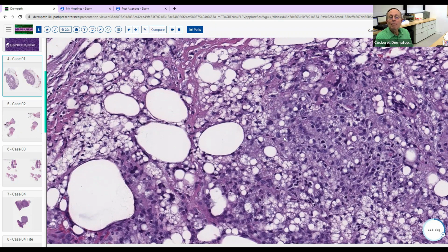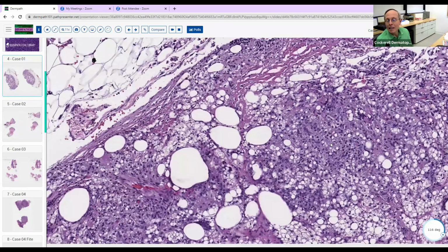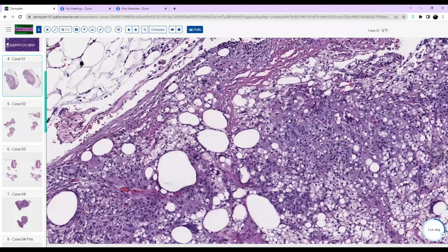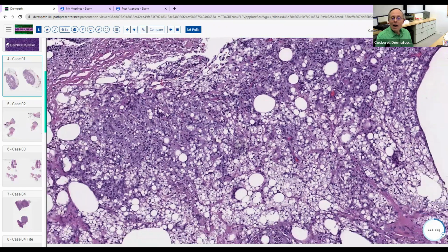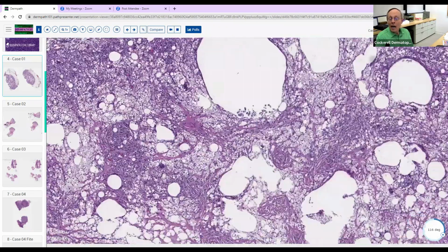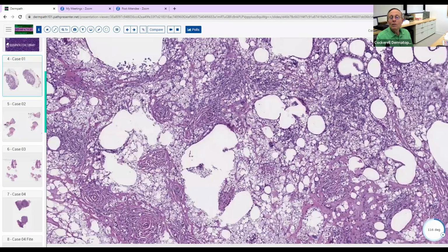What about these cells that are more histiocytes? Histiocytes. Okay, good. So when you see areas where histiocytes predominate, what kind of inflammation is that? Granulomatous inflammation. Good. So now, I could see why you might think this was a neoplasm with these clear staining cells here.